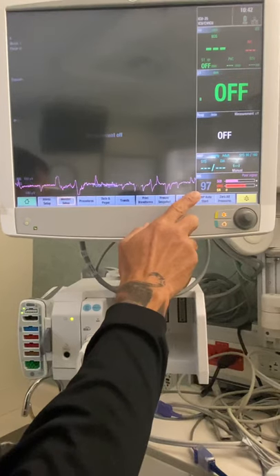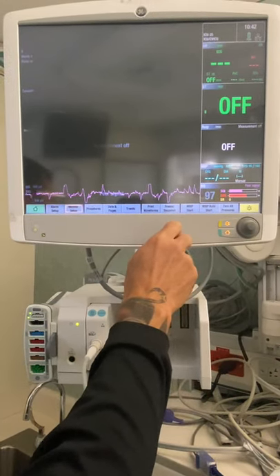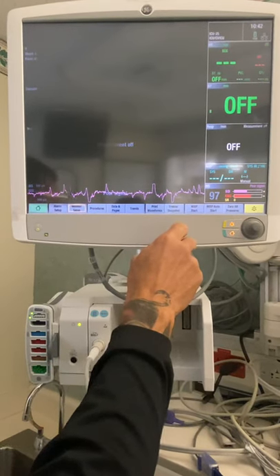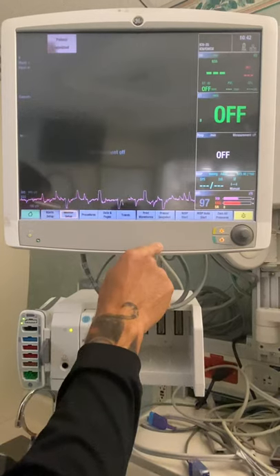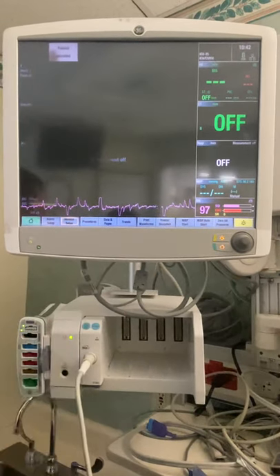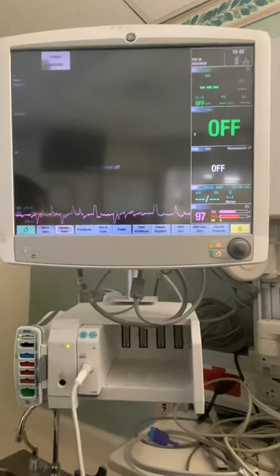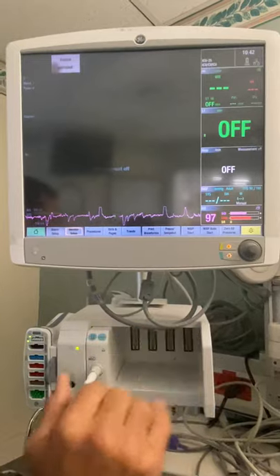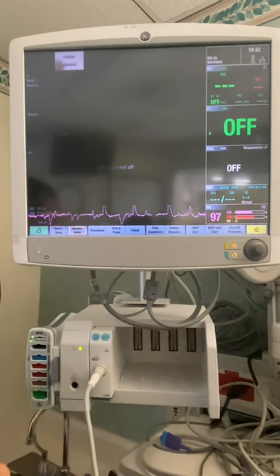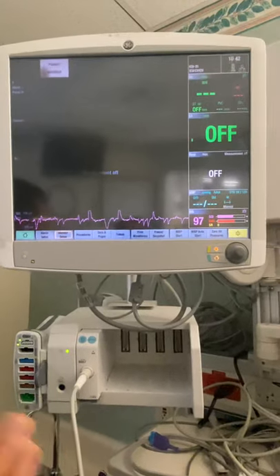100 means that the patient is fully awake. 0 means that the patient is dead. So our goal for these patients on paralytics is between 60 and 40. Anywhere between 60 and 40, you will not make any changes to sedation. None. So that is your goal. Even if it's 59, even if it's 41, you're gonna leave it alone. It means you're where you need to be.